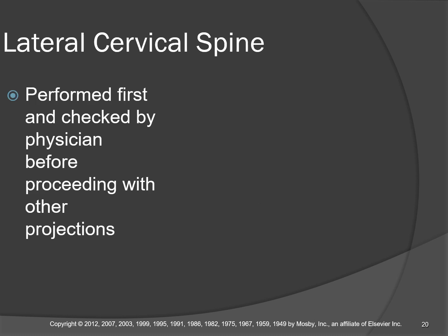All right, lateral cervical spine, performed first, checked by physician before proceeding with other projections. That's actually dated. Like I mentioned in class, when I was going over the procedure syllabus, the standard of care now for clearing a cervical spine is no longer plain views.